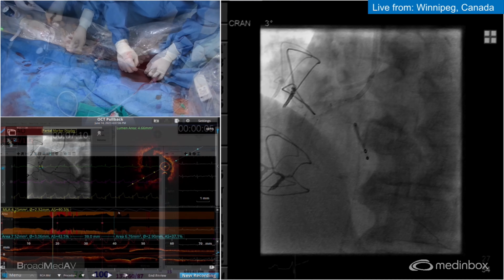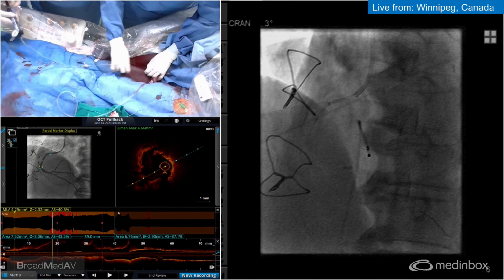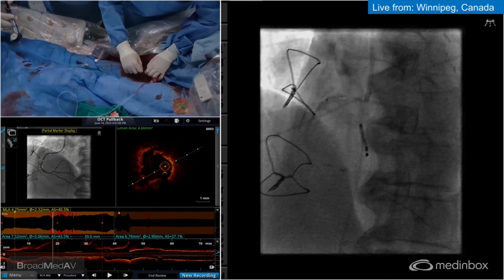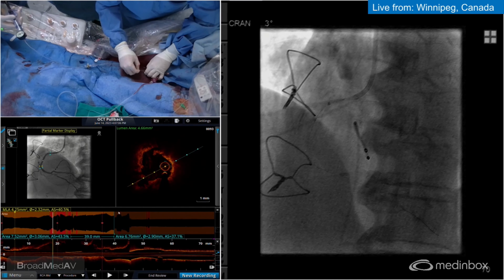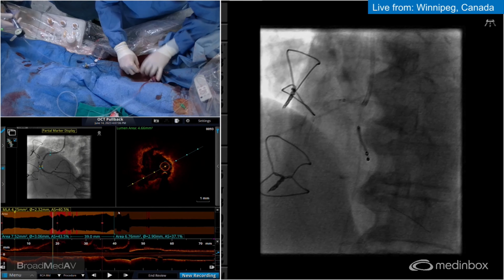Do an OCT run. What we're doing here, we have the balloon sticking halfway in, halfway out, as you can see there. I'm holding the guideliner and the balloon, pushing them as one system. That's not working. Okay, so then I'm coming down with the balloon to see if you can get it down a bit more, all the way to the PDA. Oh, that's not going either.